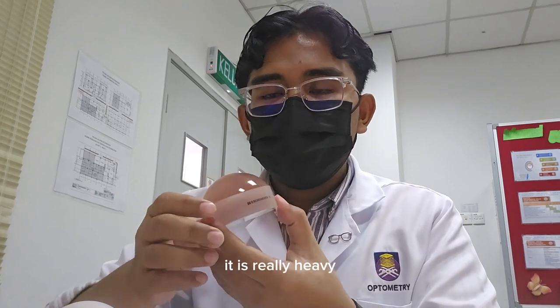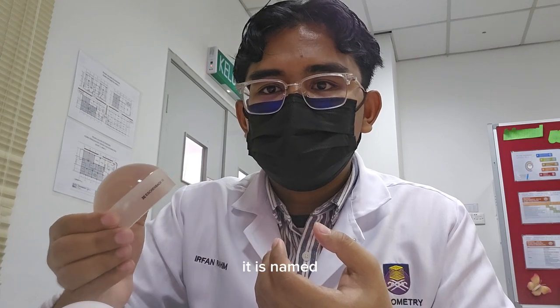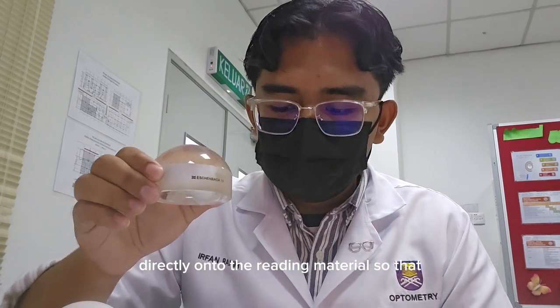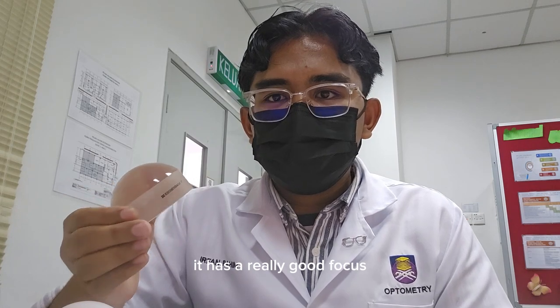As you can see, it is really heavy. Due to its heavy attributes, it is named as a paperweight magnifier, where the magnifier will sit directly onto the reading material so that it has a really good focus.